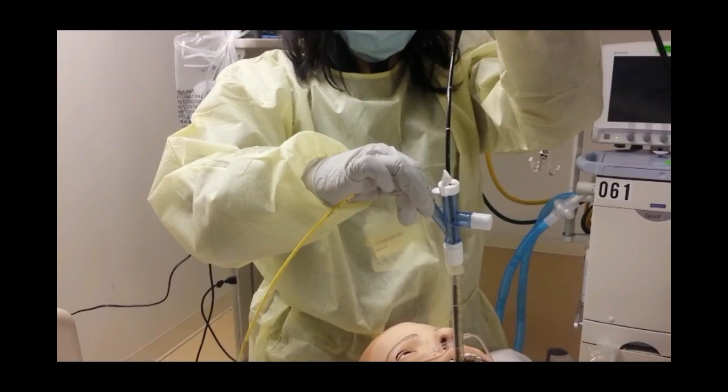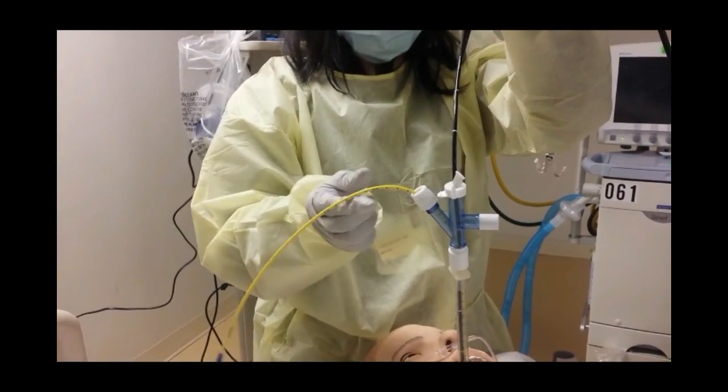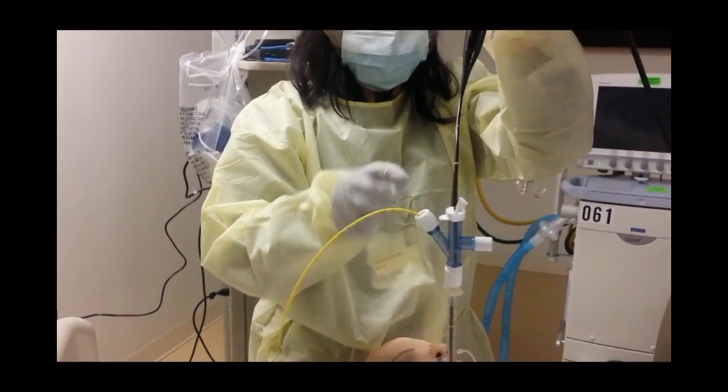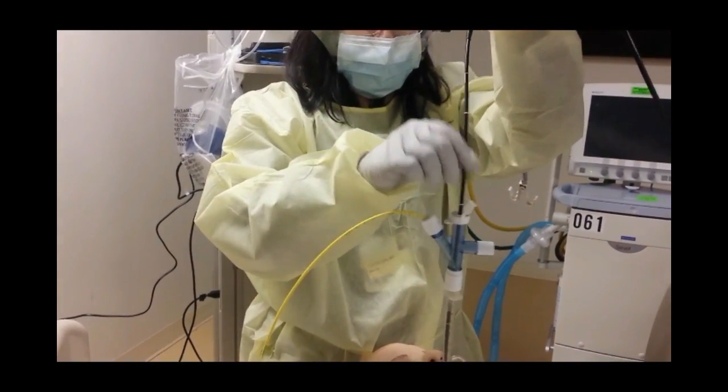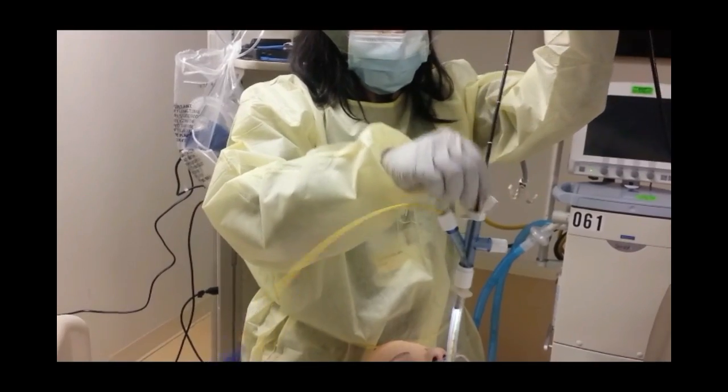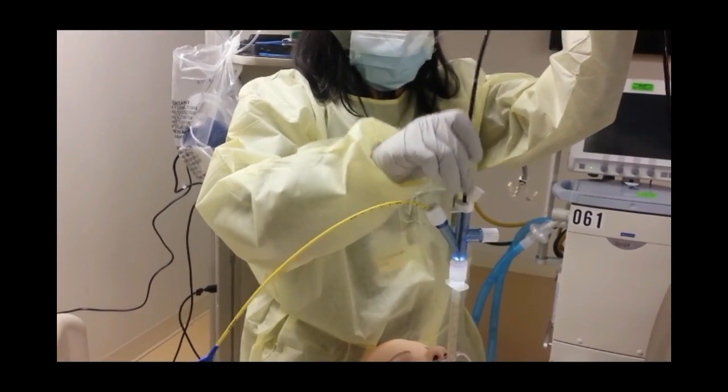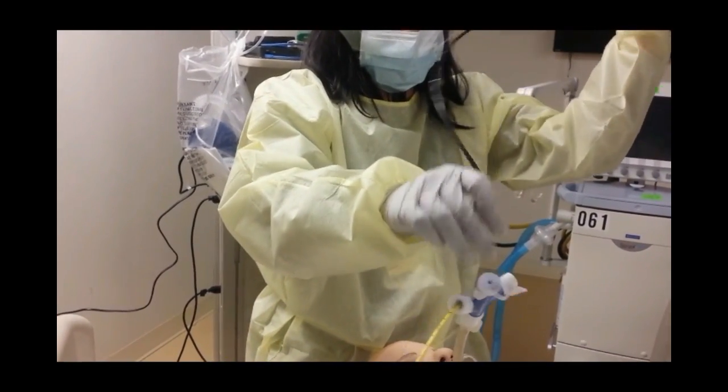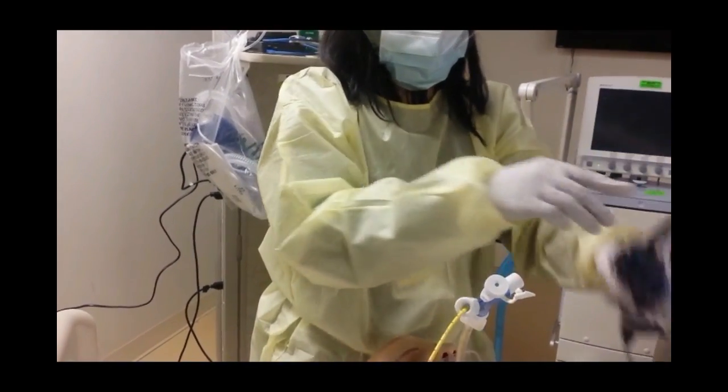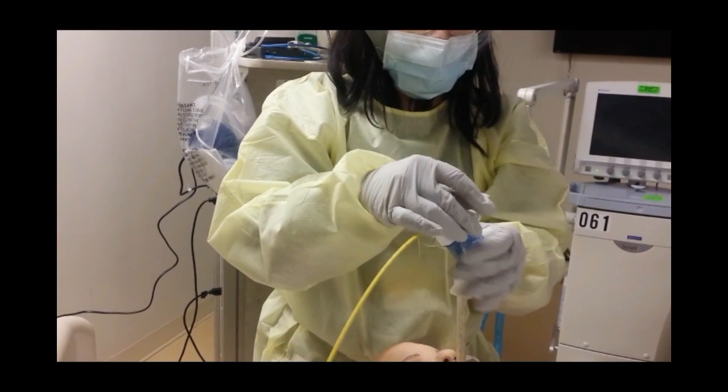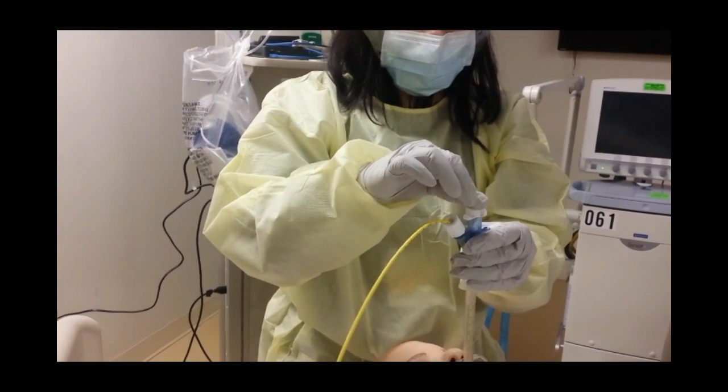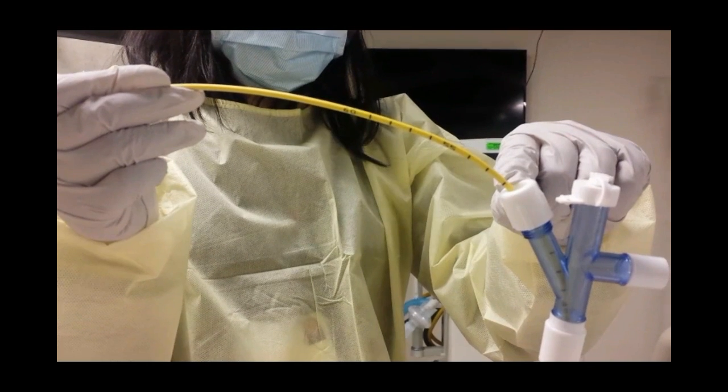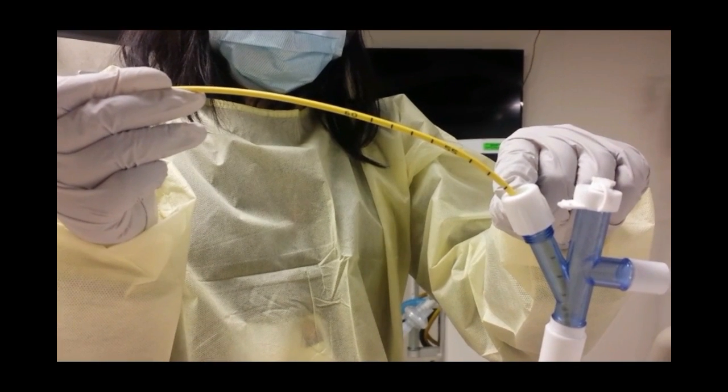Tighten the adapter around the blocker to prevent dislodgement. Suction any secretions around the bleeding area as well as the ventilated lung before removing the scope completely. Note the distance at which the blocker has been placed in order to observe any future migration of the blocker.